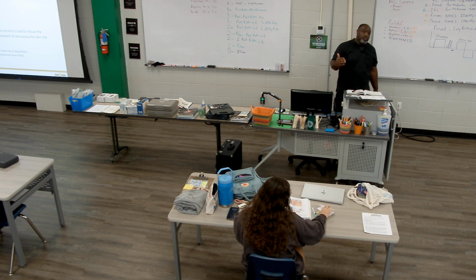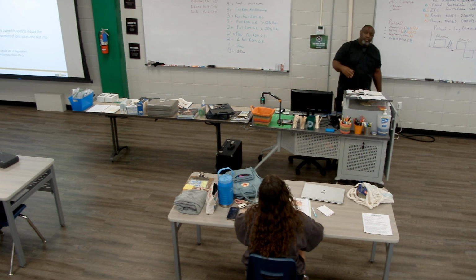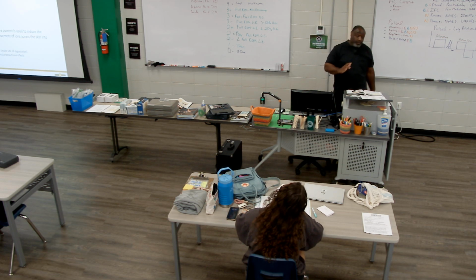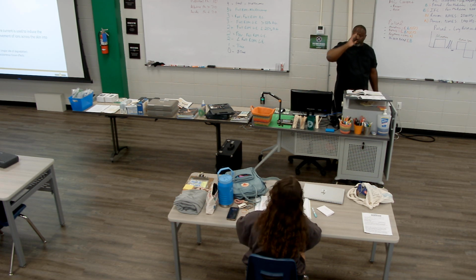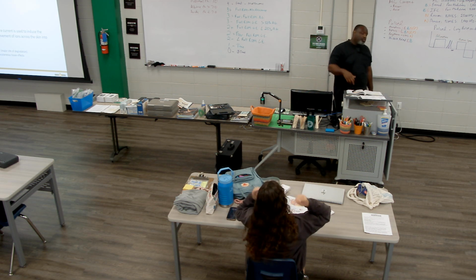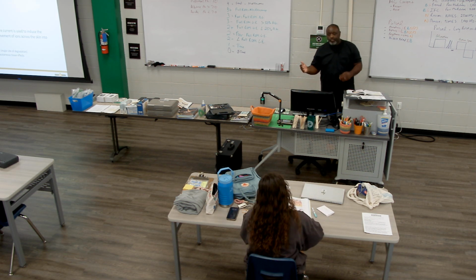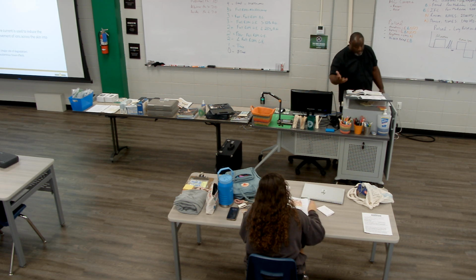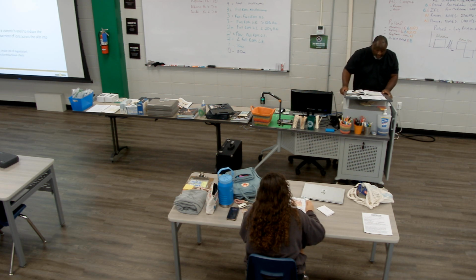Make sure you don't do therapy over the patch. You'll have to remove it. If you're doing some type of intervention technique, massage, or if you're doing STEM, or if you're doing ultrasound, whatever it is, remove the patch first. Clean the area well, do your treatment, and then you can return the patch so that everything is okay.